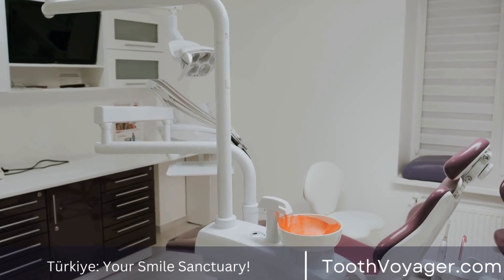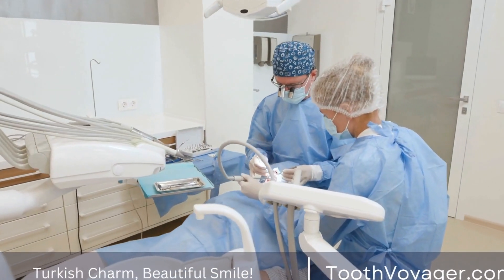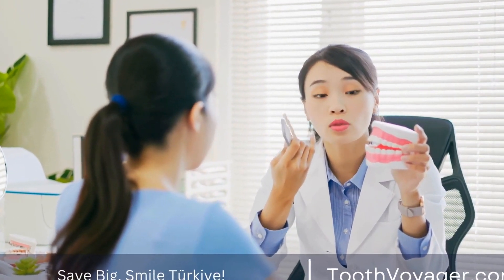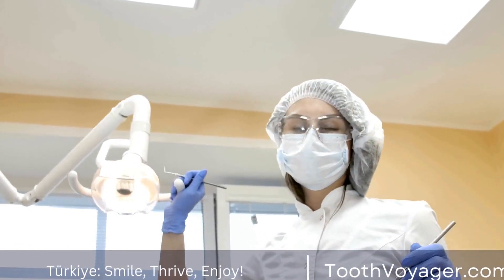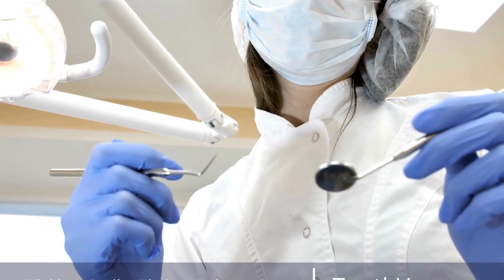What are dental bridges? Dental bridges are prosthetic devices used to replace one or more missing teeth. They consist of one or more artificial teeth, known as pontics, which are held in place by dental crowns that are attached to the surrounding natural teeth or dental implants. Dental bridges can be made from a variety of materials, including porcelain, metal, or a combination of the two.